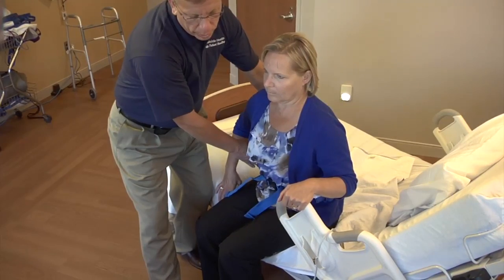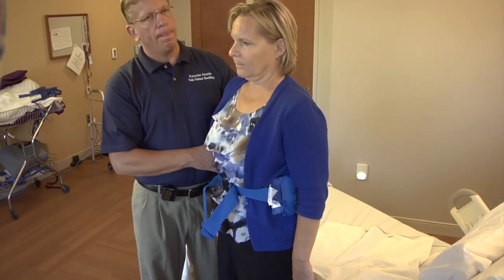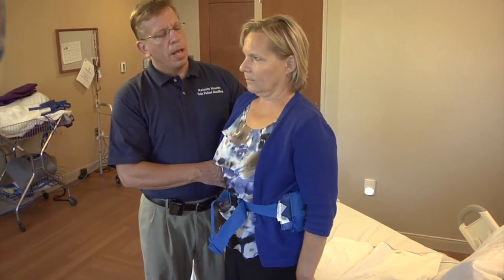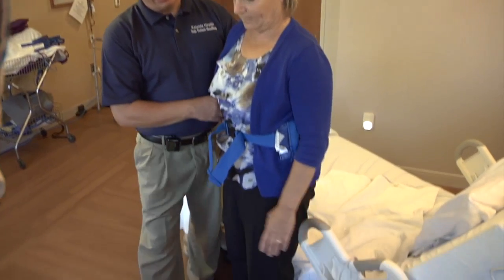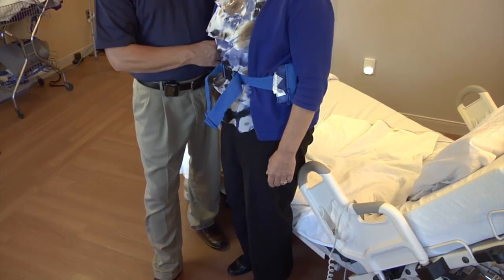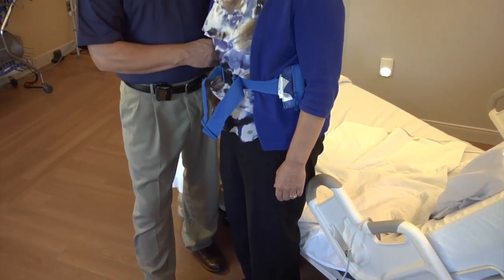Continue to talk to that patient and assess. Let me see you move your feet. Let me see you march in place. All are indicators that the patient is ready to bear their weight and walk. If a patient can't do that, you're very close to the bed, and the patient could be sat back down.